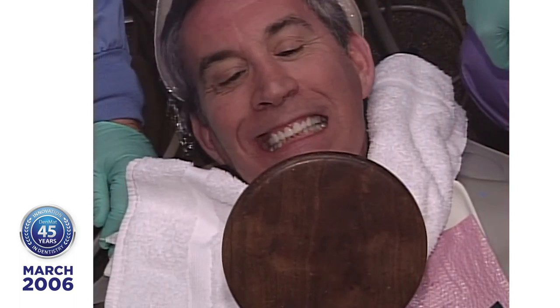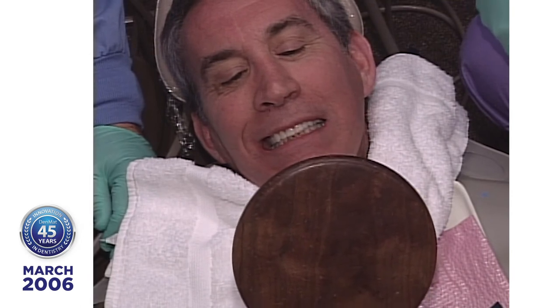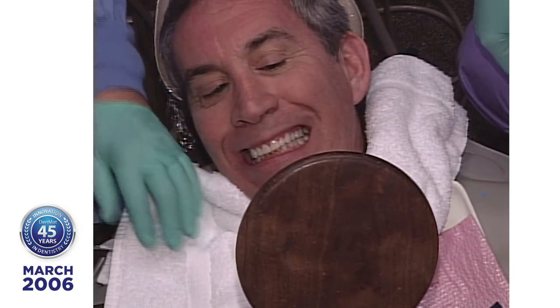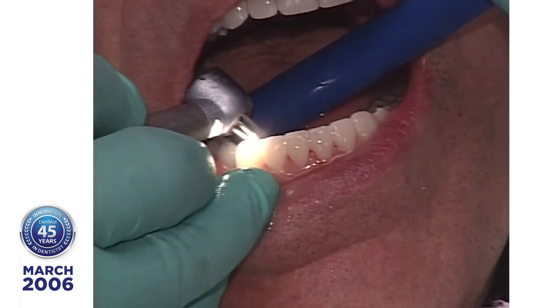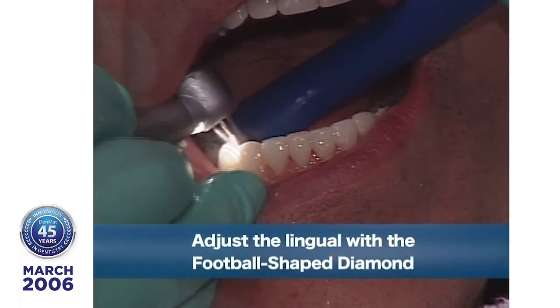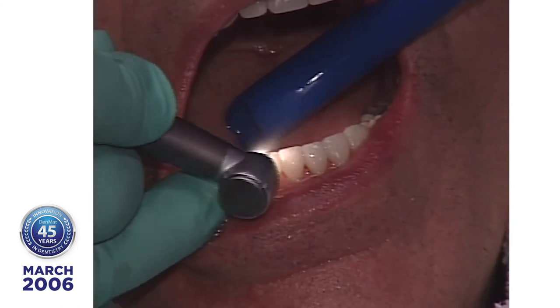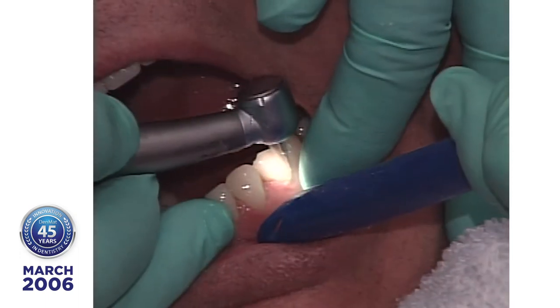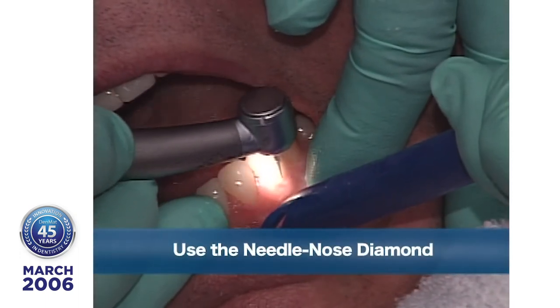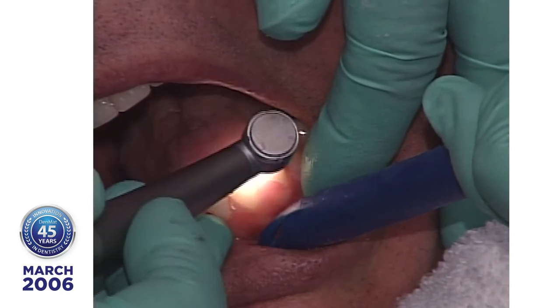I take a quick look here, see the transformation. Isn't that amazing? Huh? Okay, now we'll take the football-shaped diamond. Looking wide. Use the needle-nose diamond now. Now I'm using the long, narrow diamond.